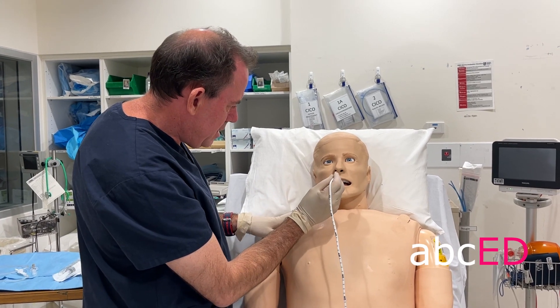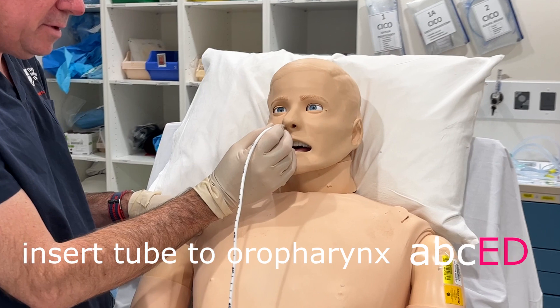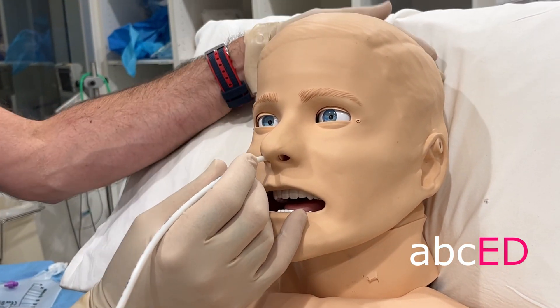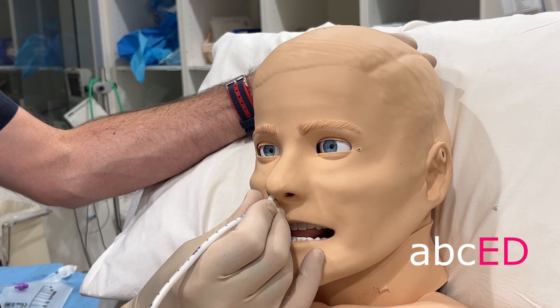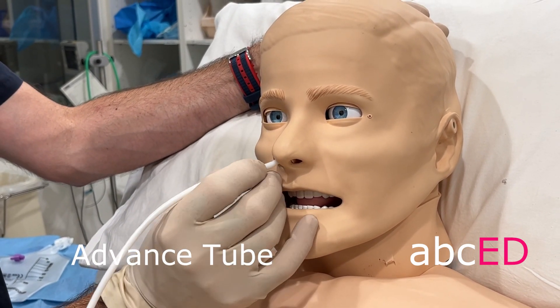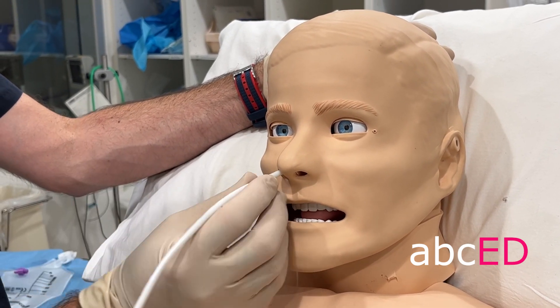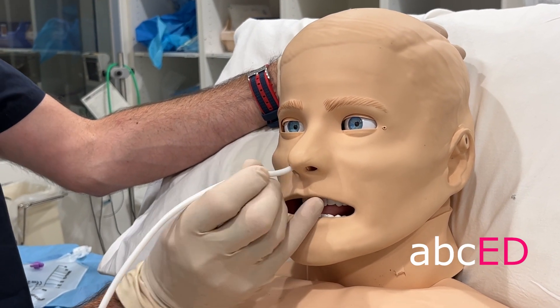Take your nasogastric tube and feed it flat along the base of the nose until you get to the back of the mouth. Then make sure the patient's head is flexed forward — if they can cooperate, get them to swallow. Once they're swallowing, just rapidly advance the tube down. If they have trouble when it hits the back of the throat, you can get them to drink a glass of water and swallow as you feed it.